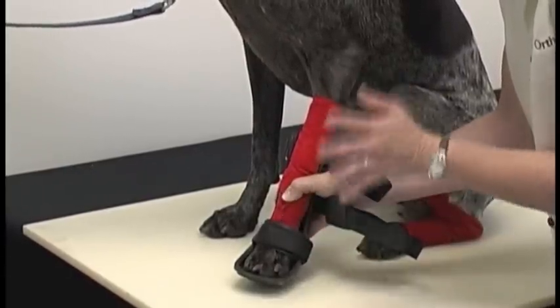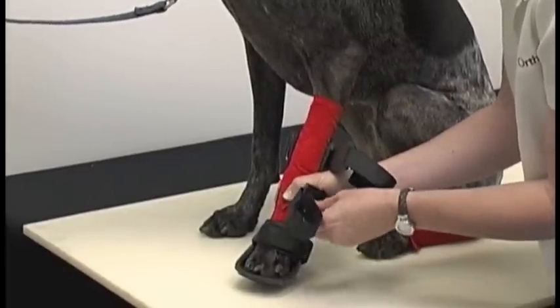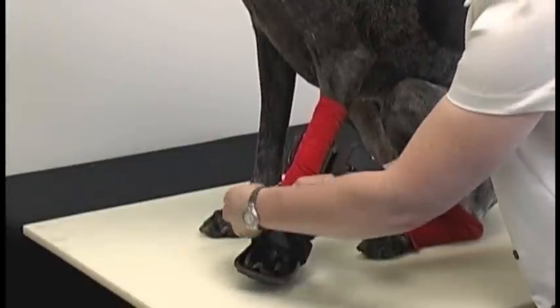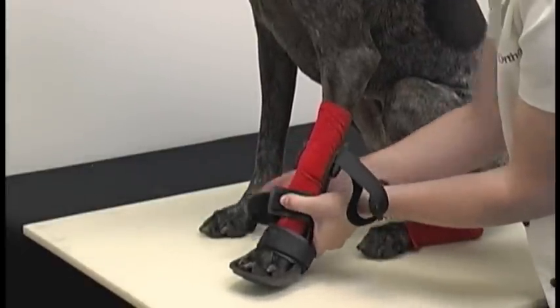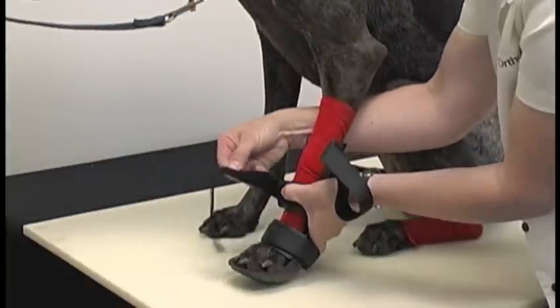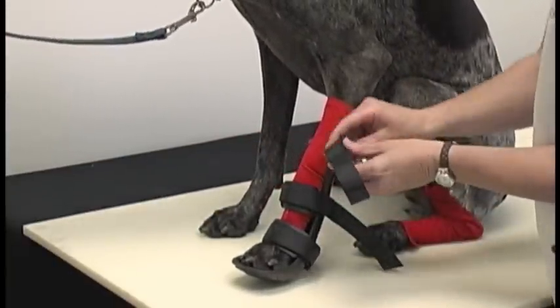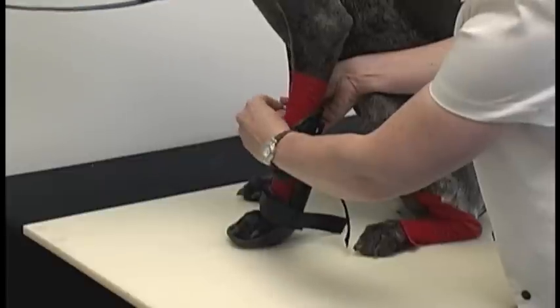If the dog is moving around on you, you can go ahead and secure the fit. Then go with the next strap — the middle strap. I'm just going to place this strap around the front limb splint like this. Middle strap and then your top strap. Our dog is being very good today letting us fit this.